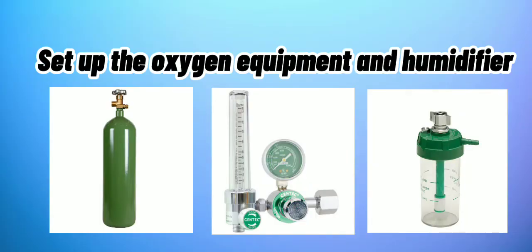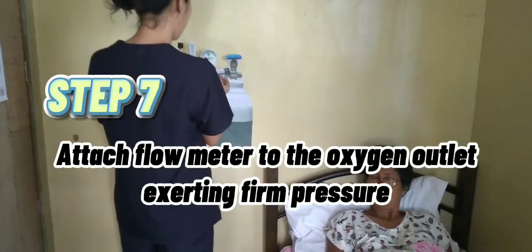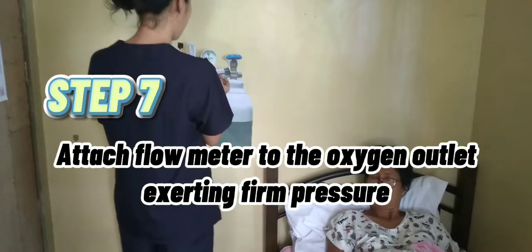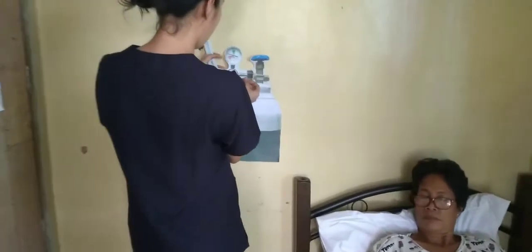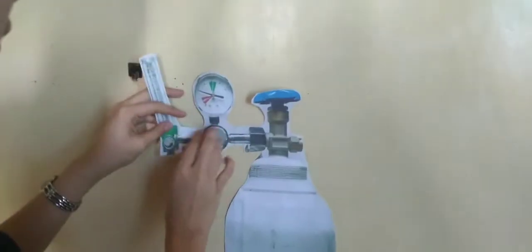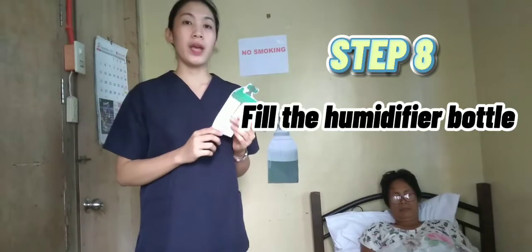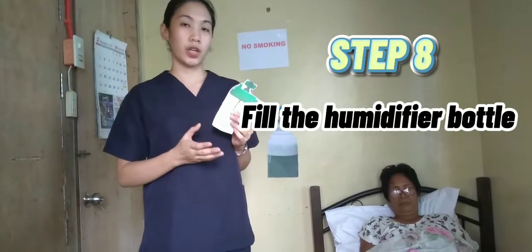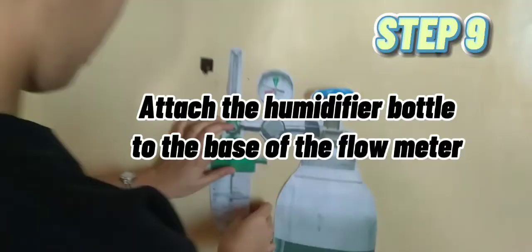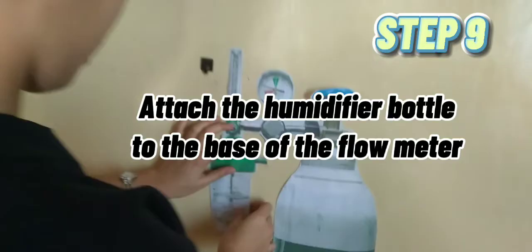Set up the oxygen equipment and humidifier. Step number seven: attach the flow meter to the oxygen outlet, exerting firm pressure — the flow meter should be in the off position. Step number eight: fill the humidifier bottle with distilled water up to the level mark, or if there is no level mark, fill it half full. Step number nine: attach the humidifier bottle to the base of the flow meter.